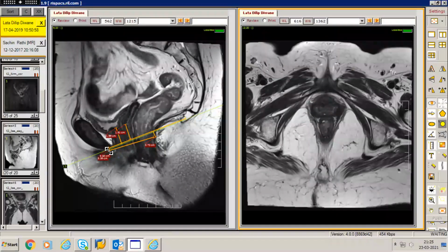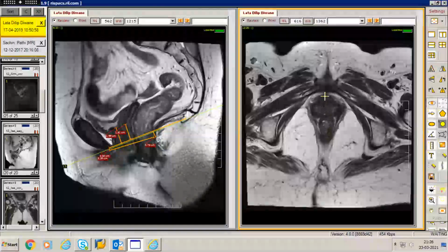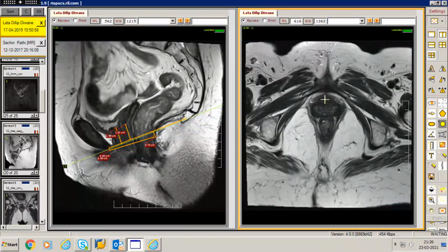So if you were to take the H line, which is drawn over here, the counterpart to that on the axial image would be something going in this particular direction from the anterior posterior location, going all the way posteriorly over here. The pubococcygeal line is taken as a landmark for you to understand that you're looking at the vertical descent with respect to the pelvic floor, whereas your H line talks in terms of anterior posterior extension of the pelvic floor hiatus itself. So the levator hiatus would be governed by the AP diameter by the H line, and vertically you're taking the pelvic floor landmark as the pubococcygeal line itself.